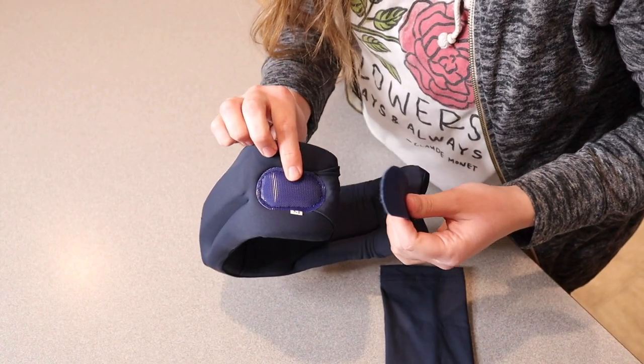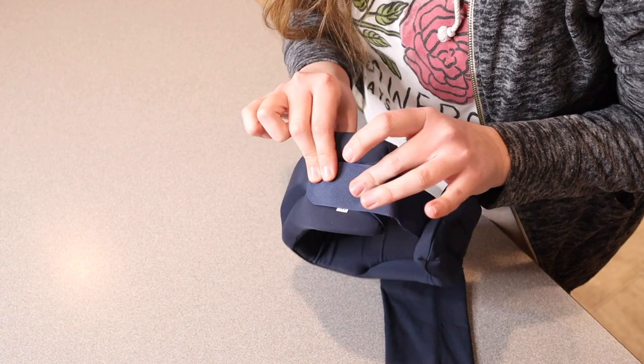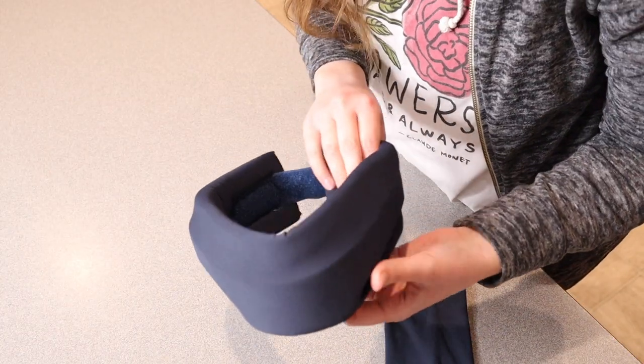I picked the medium size, but there are a couple of different sizes, just to make sure that you get one that fits you perfectly. There is a sizing chart online as well.